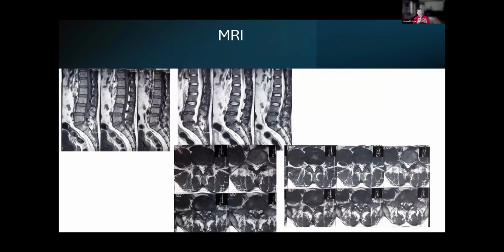The uniportal is really taught as a bone sparing, anatomy sparing approach. You can still, if you are advanced and comfortable in your uniportal approach, do an aggressive bony decompression. It's not to say that it cannot be done, but it's typically not the initial training in the uniportal world. But biportal, you can take down the base of the spinous process, come across the top, take down the contralateral lamina. So you can get the decompression.